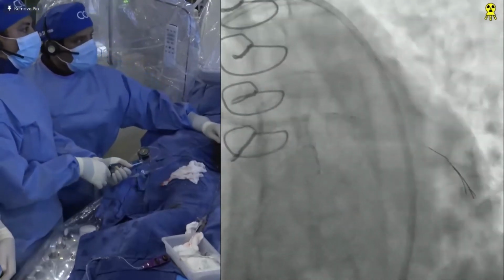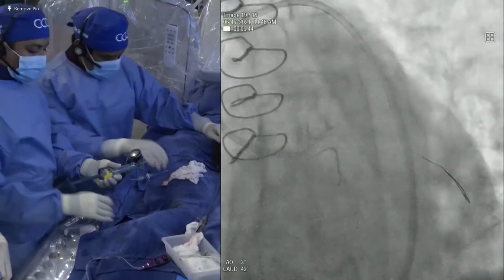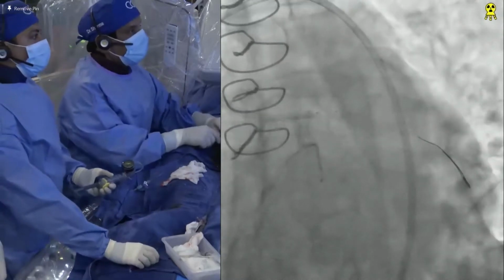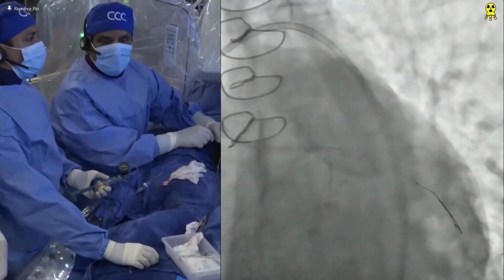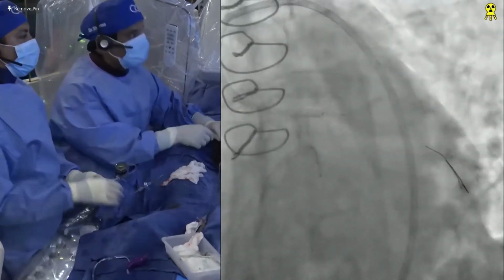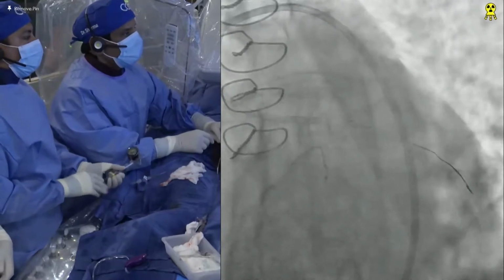Keep going. One second. Negative. Yeah, it did not expand; it moved out. You have 3.0? Give me the 3.0 right now, and then bring a 4.0 also. Okay, then give a 4.0. This is a big case. Yeah, go up again, slowly.